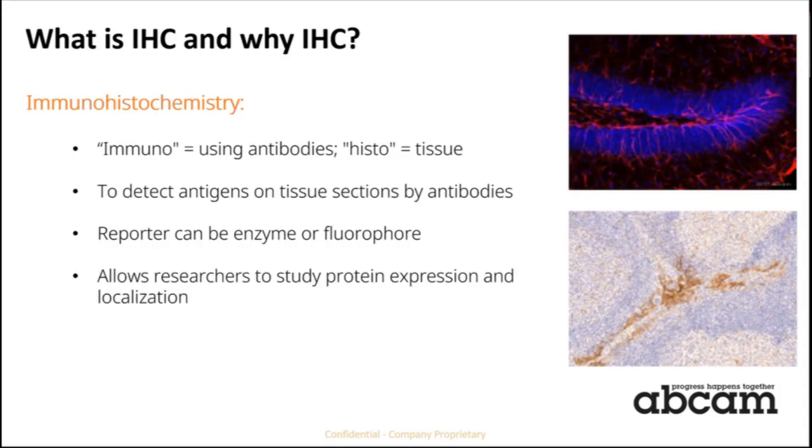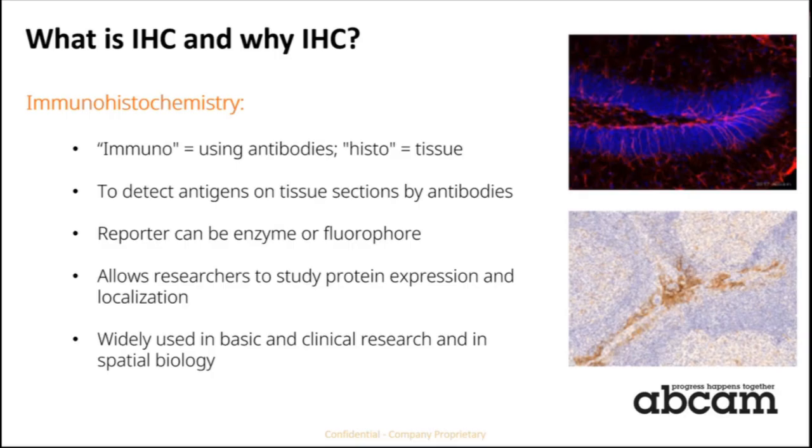Because of this, IHC is an important tool for researchers to study protein expression and localization, and it is widely used in basic and clinical research, and also more recently in spatial biology, which is a growing field.